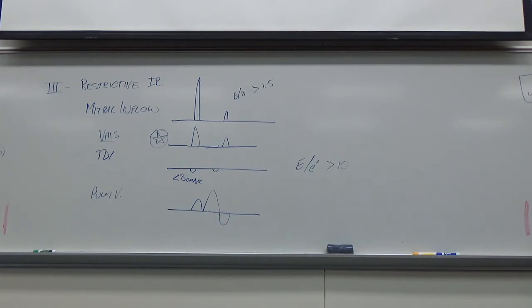I'm just looking at this chart real quick. So I never wrote it up here, but just an additional piece of information if you wanted was the IVRT. So the IVRT, remember, is the isovolumic relaxation time. That is after the LVOT flow and before the E wave. Normal is 70 to 90. Impaired goes greater than 90. Pseudonormal goes back less than 90. And then both the restrictive reversible and irreversible are less than 70. So again, they don't differentiate between each other on that, they're just less than 70.